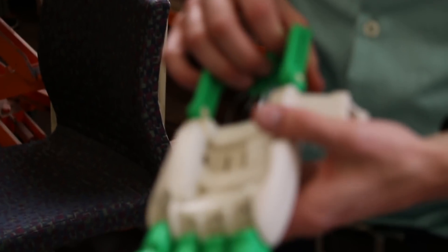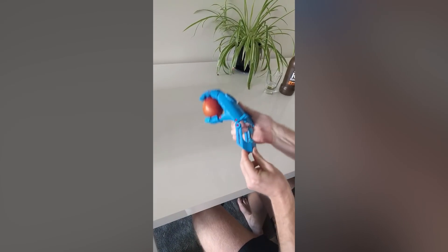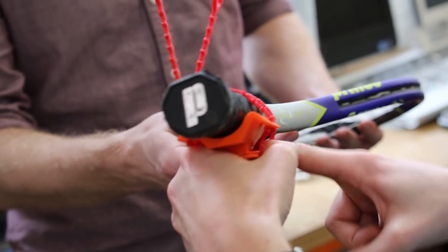For the trials, it starts off pretty simple — just introductions with the candidate and their family, because these are kids coming in with their parents. Then we show them the hand, explain how it works off the wrist action and how the fingers grip. Then we go through a fitting process, make sure their reduced hand fits inside the prosthesis, and teach them how to put it on themselves, making any adjustments or adding foam lining if needed. After that, we try gripping a few things — starting with a tennis ball or an apple, moving up to a glass and a drink bottle. Then we try the attachments: a tool holder for cutlery, a larger tool holder with a skipping rope handle, and a tennis racket.